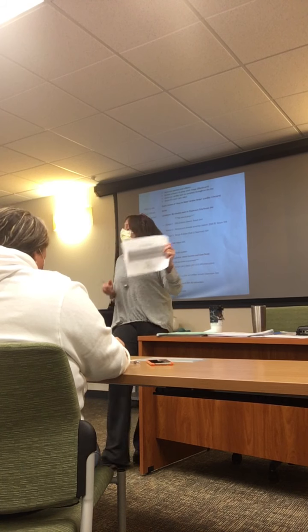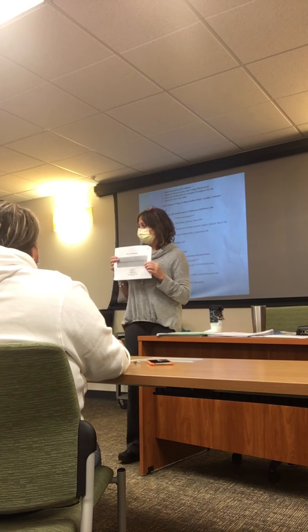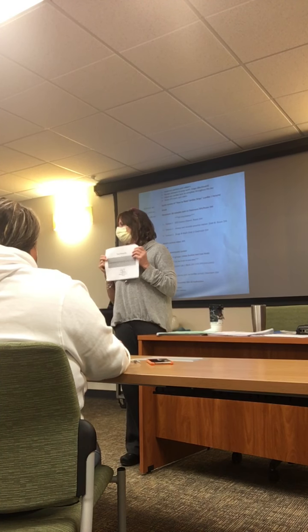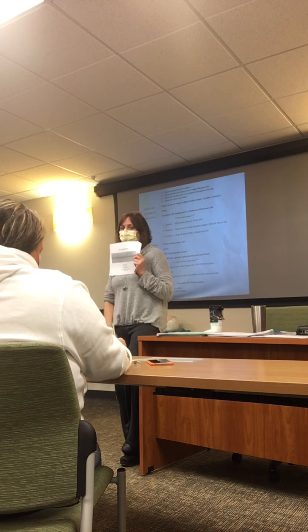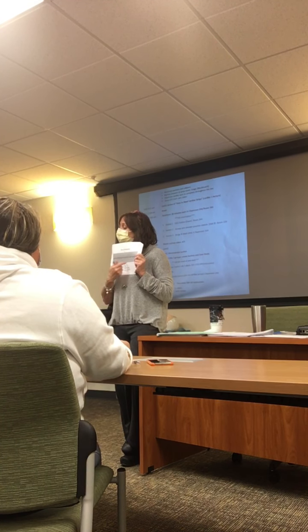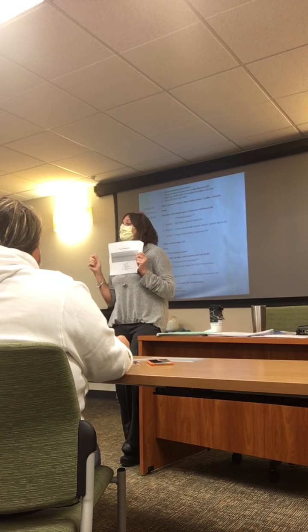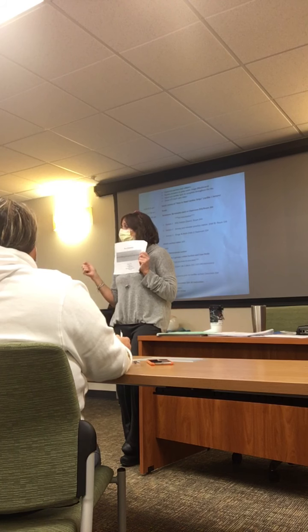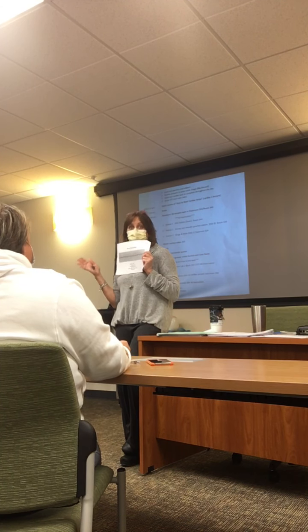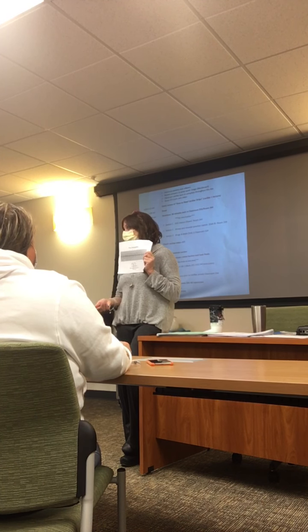So what I do when I identify a person as in sinus tach, I want to assess for signs and symptoms. What kind of signs and symptoms would be concerning to you if a person was in this rhythm? Chest pain, if they're having chest pain, because what does this heart rhythm do to the myocardial oxygen demand? Increases it. So if a person just had a heart attack and they come in and their heart rate is 200, what is their myocardial oxygen demand like after it's already been injured? So we've got to get that heart rate down.